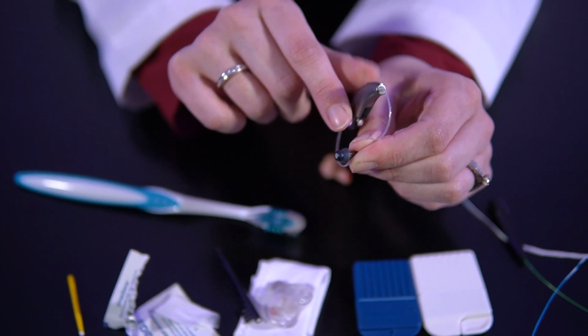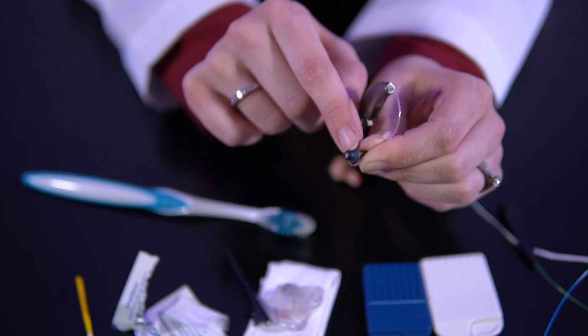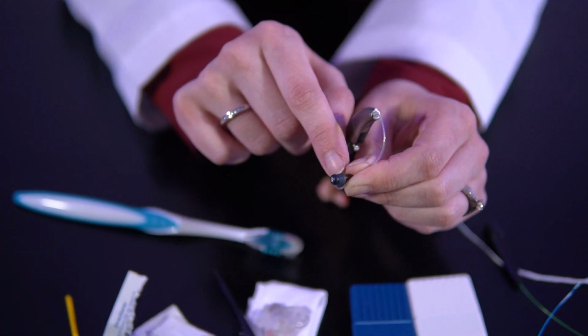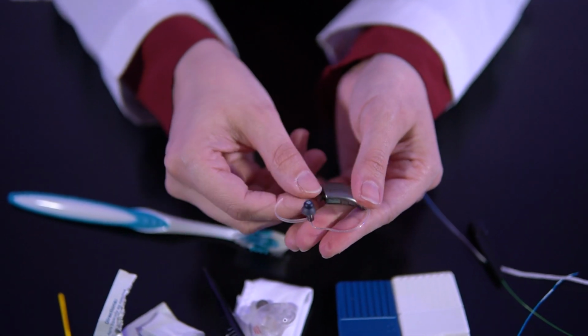And if you ever replace a dome and then all of a sudden you pull your hearing aid out of your ear and the dome is gone, don't keep adding more onto it, because there's a good chance that you might have gotten one stuck in your ear. So come in and see us and we'll take it out of your ear. Don't try and use tweezers or anything like that to pull it out, okay?